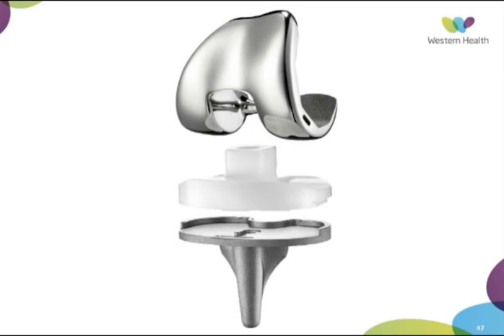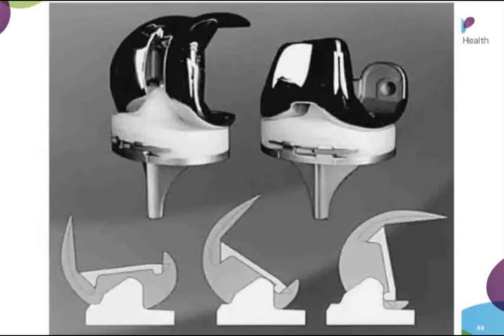Here's an example of a posterior stabilized knee. As you can see, the post in the polyethylene insert, and in this diagram here, you can see that as the knee flexes, this post engages here, which will then stop the femoral component translating forward. And then as it flexes more, the point of contact goes from more anteriorly to more posteriorly. So that's recreating that femoral rollback.